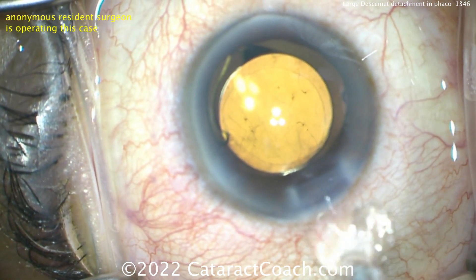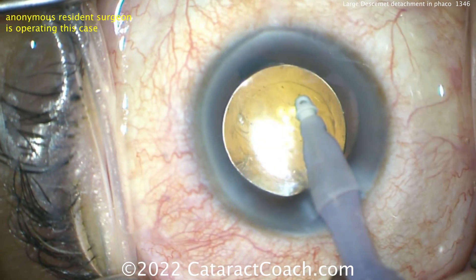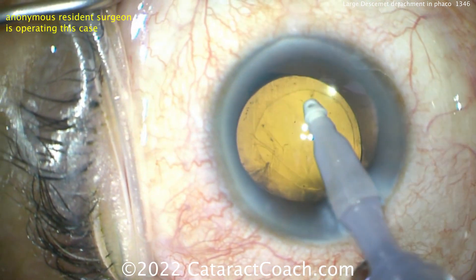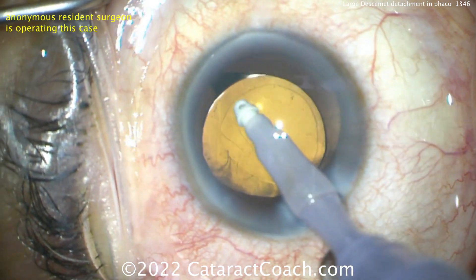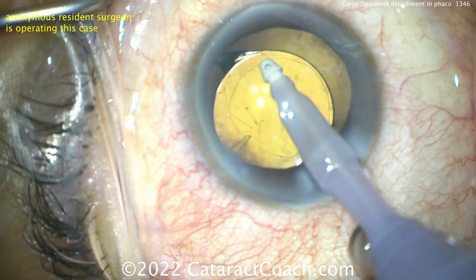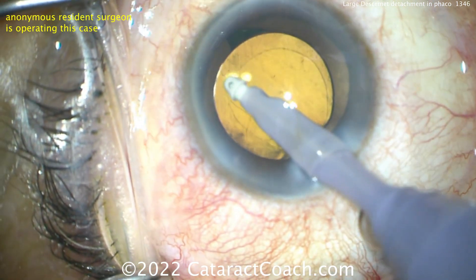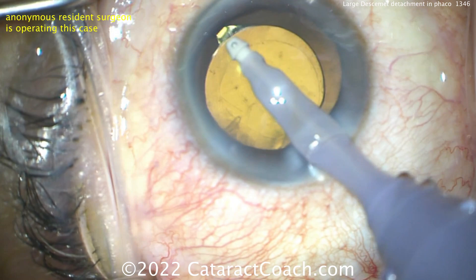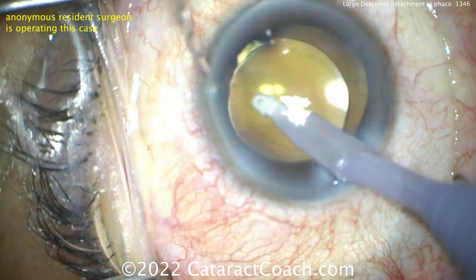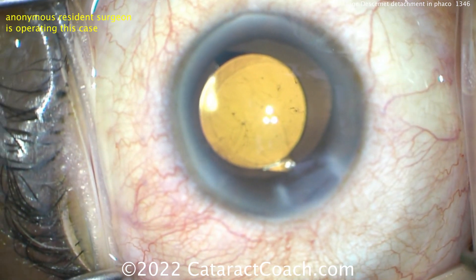If you're not careful, you can go in with the I/A probe and make it even worse. The attending was pointing out: there's a huge detachment. From the incision there's a big strip of detachment, which was aspirated. You're not going to find that membrane now — it's not like you can place it back. If you had just a flap, you could put it back and use a gas bubble to hold it in position. But this is a complete loss of that piece — a strip of the central endothelium is now gone.